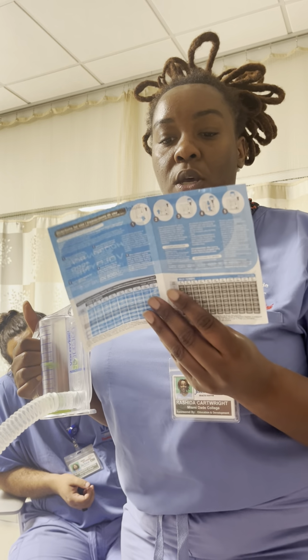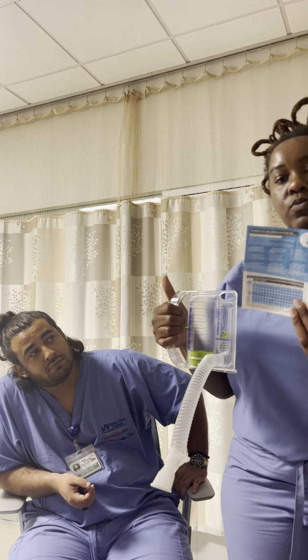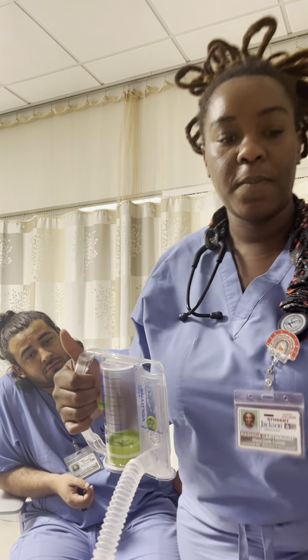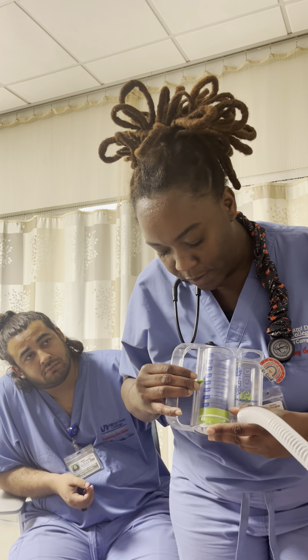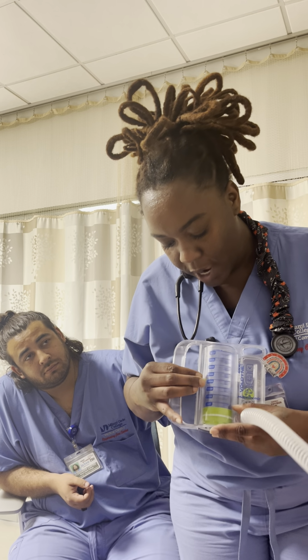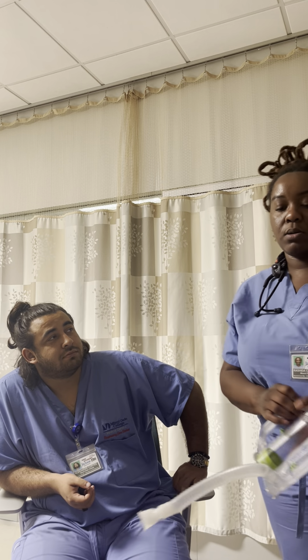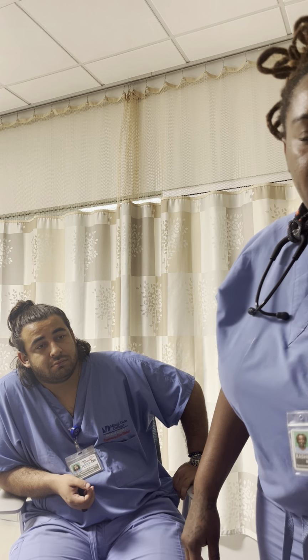And we have the paper here that came with this device, and it is based off the patient's age and the patient's height. That's what we will put the volume for. So for a person that's 25 and 6 feet, we will put this here at 2150, which is approximately right there. Okay. So we have our equipment.